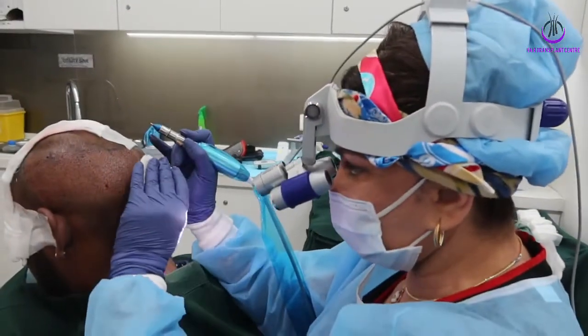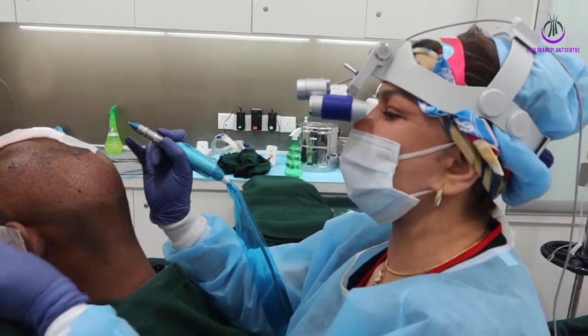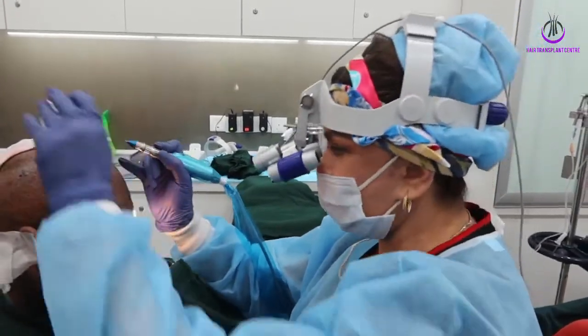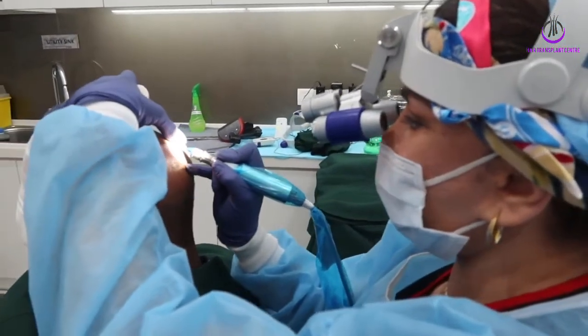Okay, so we have just harvested half of the side. Now we're going to do the boxes on the right hand side. Basically this whole process is called harvesting of the grafts.